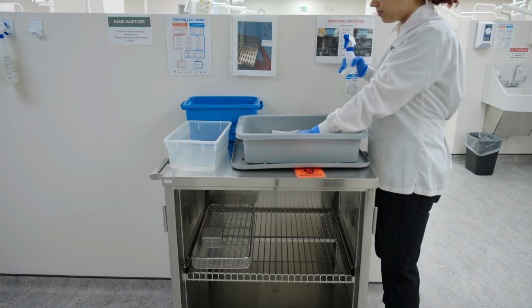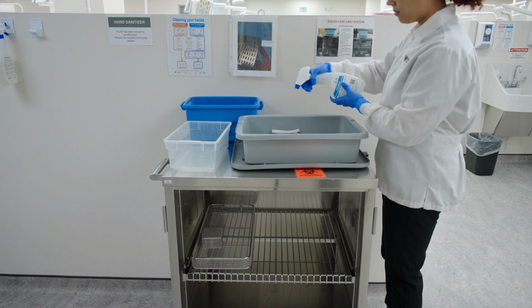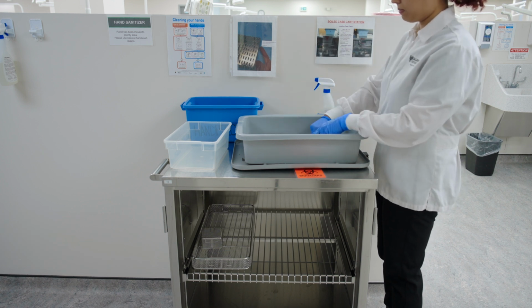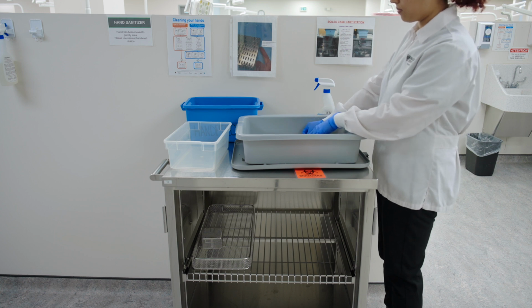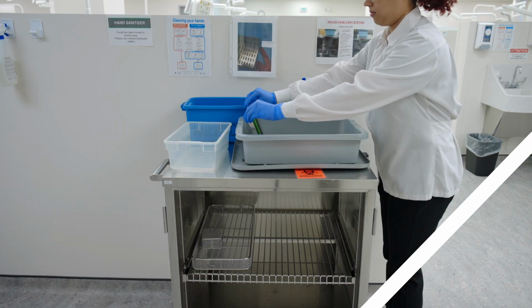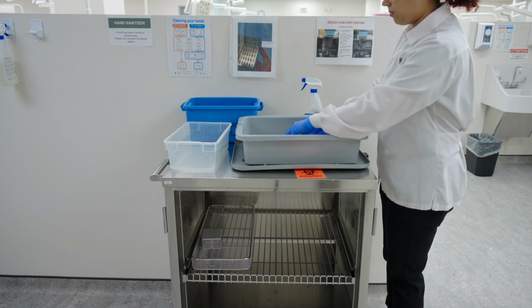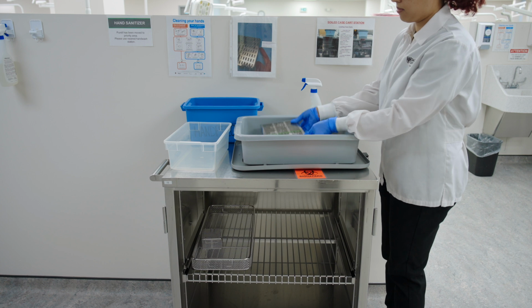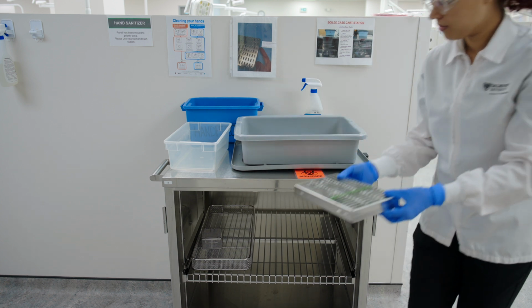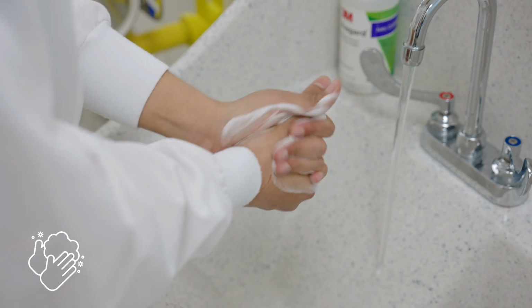Place inside the gray bin located on the top of the cart. Open the tray and spray pre-cleanse evenly over all soiled instruments. This will pre-clean the instruments and prevent the formation of biofilm. Once sprayed, securely place the lid back on the tray and ensure instruments are not sticking out of the borders of the tray. Place the tray inside the soiled instrument cart in an orderly fashion. Remove gloves and perform hand hygiene.